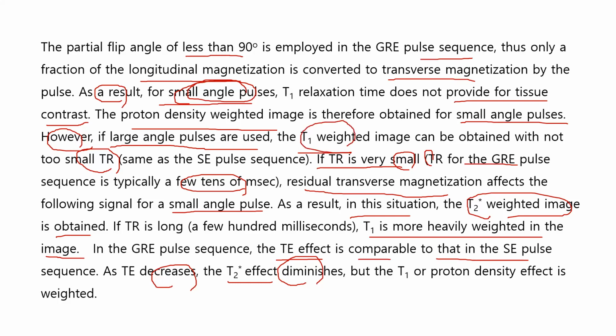And if you use a very short TR, then a T2 star weighted image can be obtained. So the image style is different according to what TR time is used.